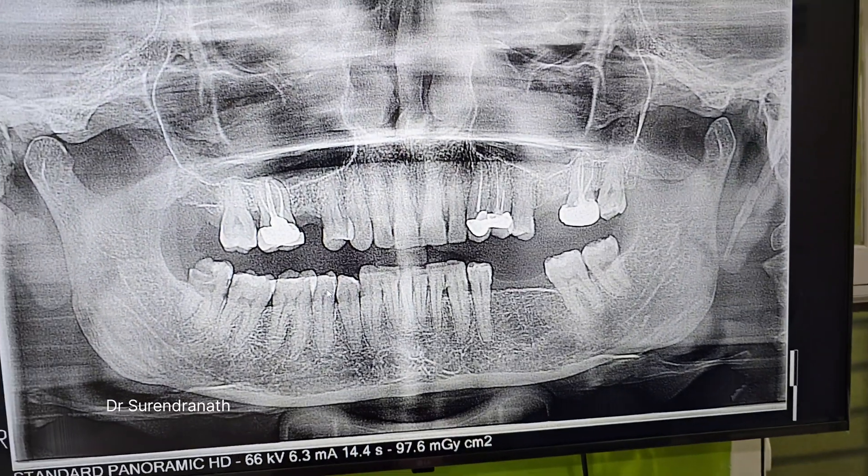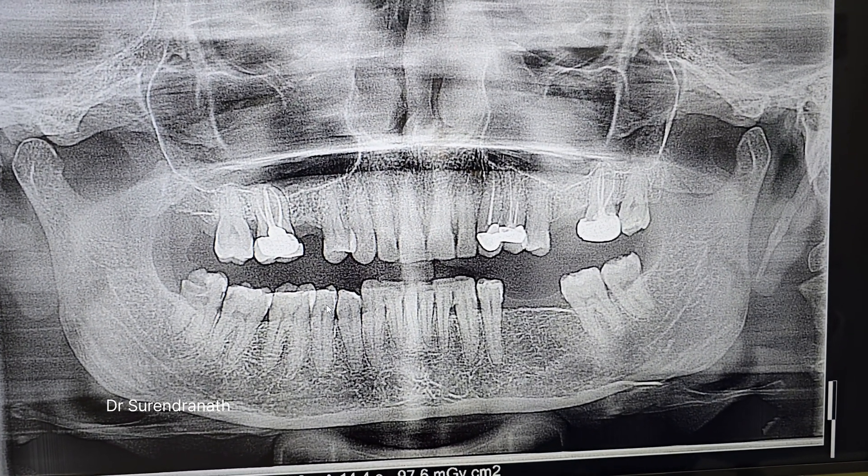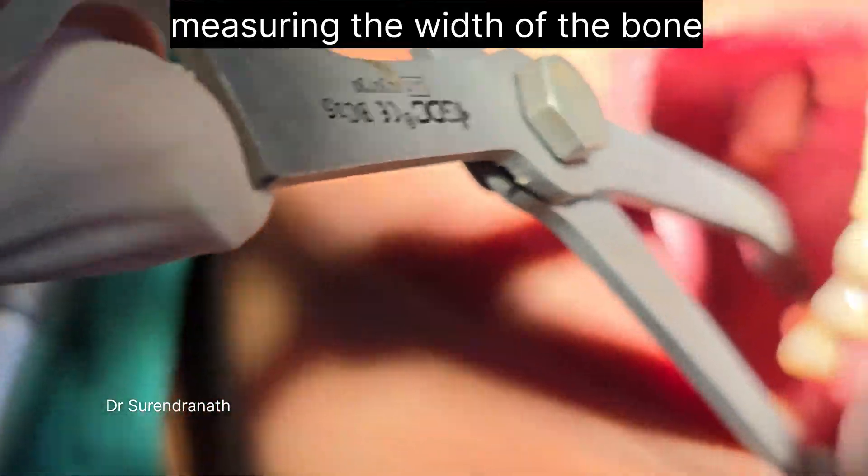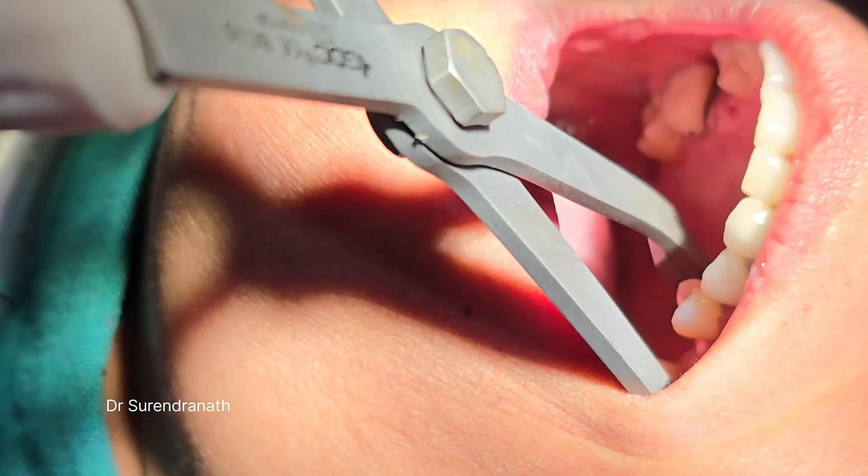And then you can see the x-ray — so we have just 6 mm of bone. That is why we are doing the sinus lift procedure for the upper teeth. And here it is around 7 mm, you can see.